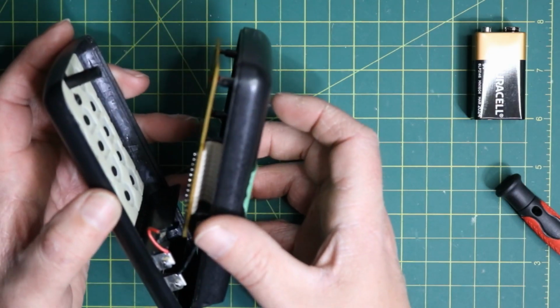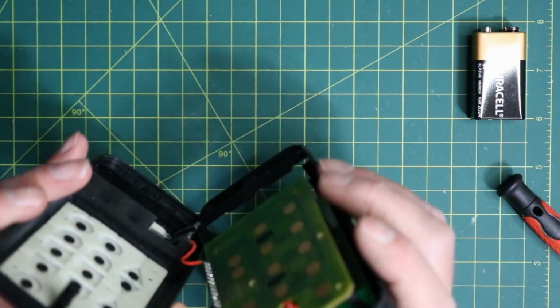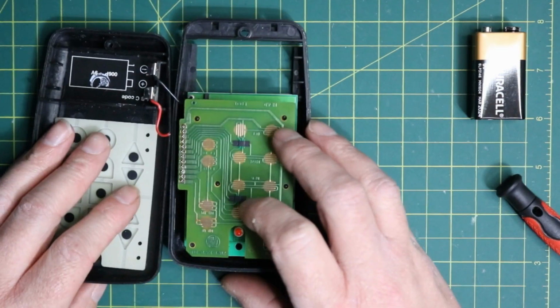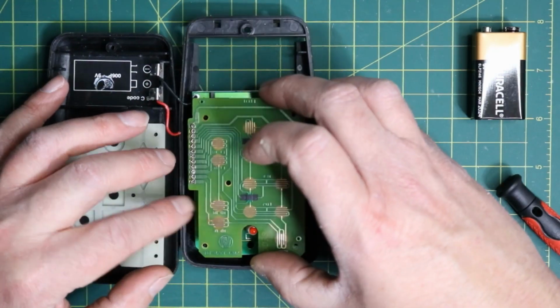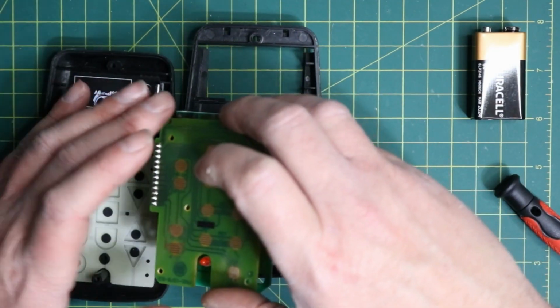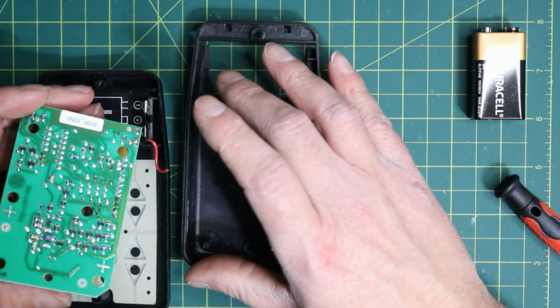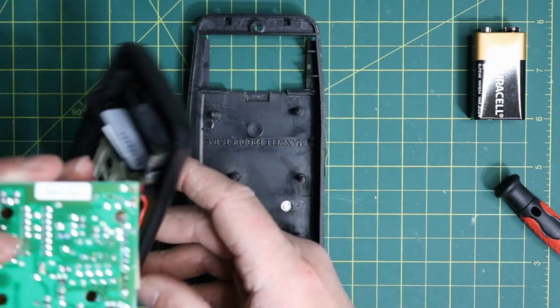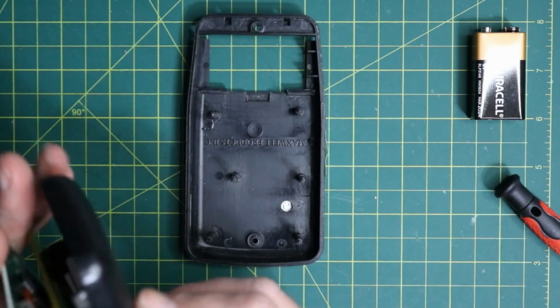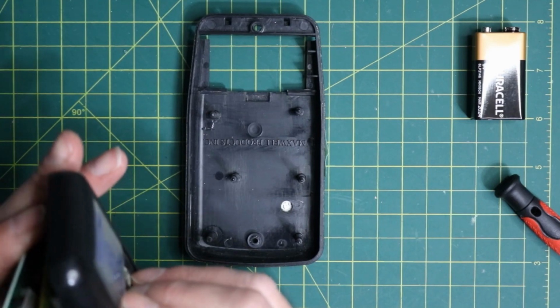So the first thing I notice is the power cable for the 9-volt battery is not connected. So we're going to have to get that soldered back on there. But the first thing we'll do before I go ahead and do that is we'll get this all cleaned up. But I'll just show you where the power is going to go here. So on the bottom there, it's going to be the second pin down.